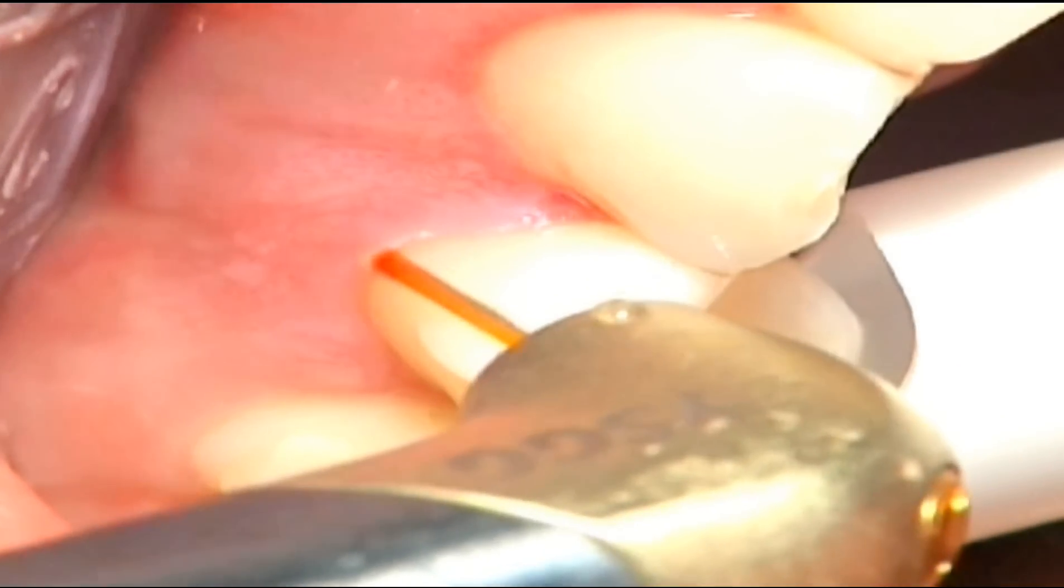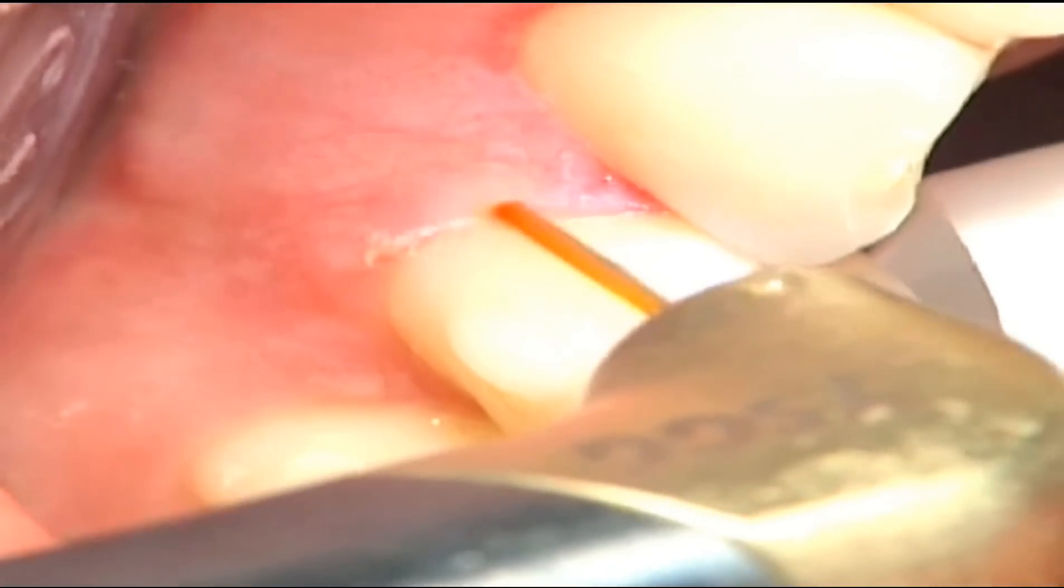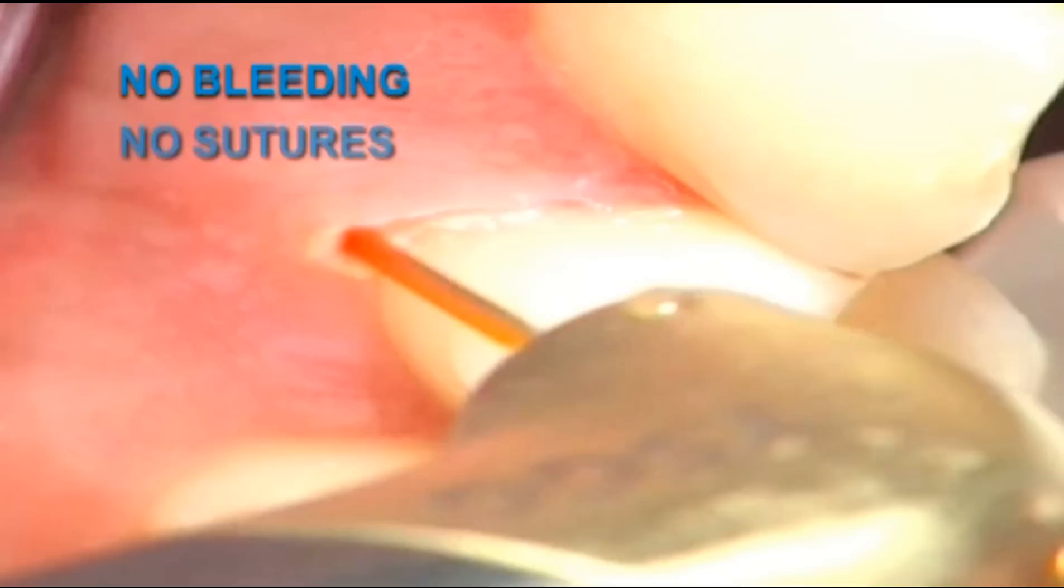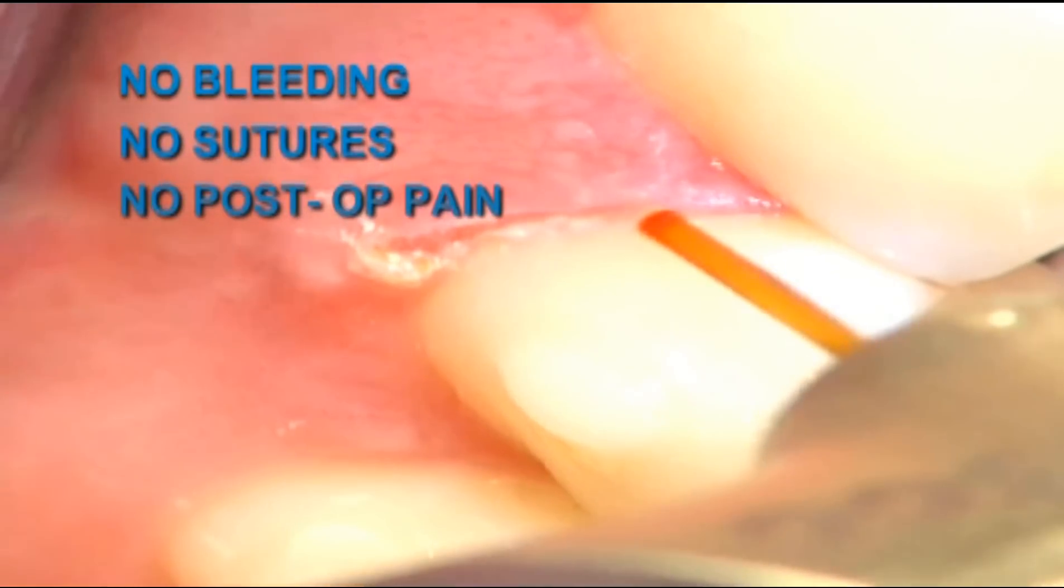Do you avoid performing soft tissue procedures that your patients need? If you're like many dentists, you just don't want to deal with the bleeding, the sutures, and managing post-operative pain, right?